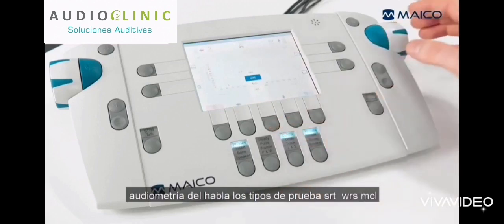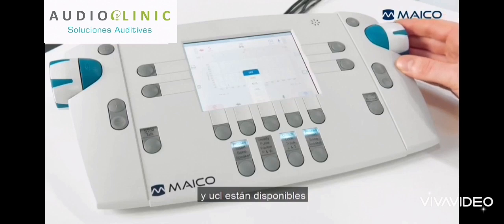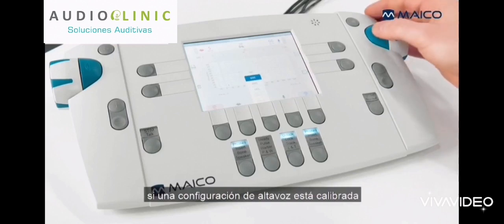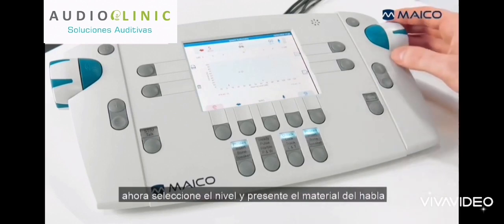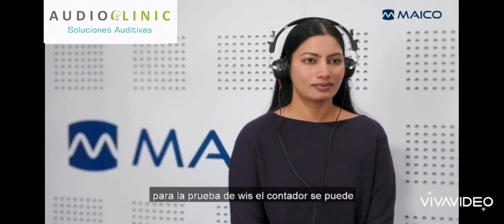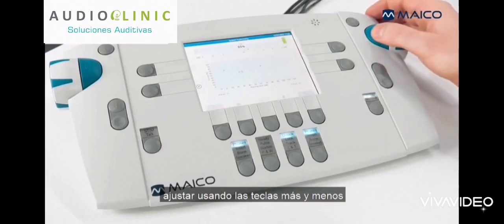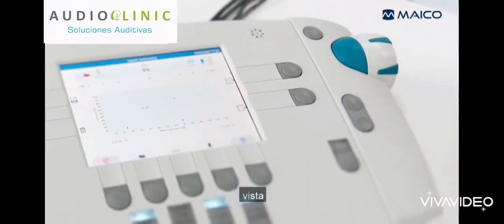Choose the test type. In speech audiometry, the test types SRT, WRS, MCL, and UCL are available. If a speaker configuration is calibrated to the MA42, SRT and WRS aided are also provided for selection. Now select the level and present the speech material. For WRS testing, the counter can be adjusted using the plus and minus keys. Then store the result and continue with another speech test or change the ear side.